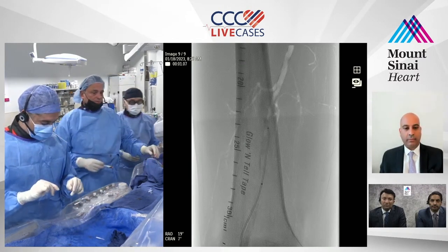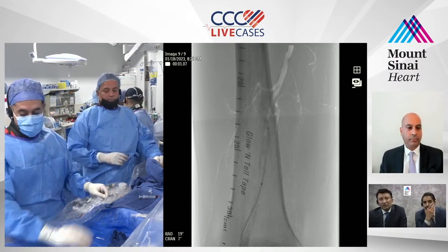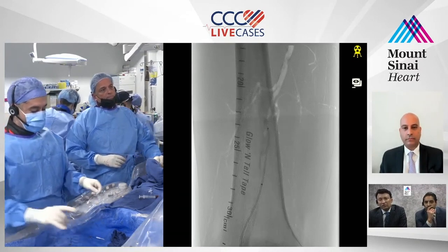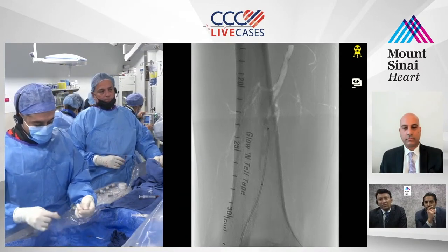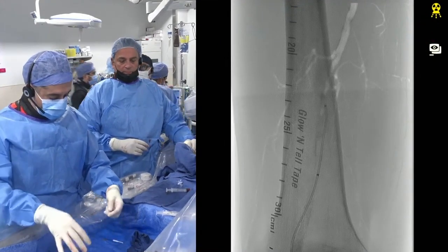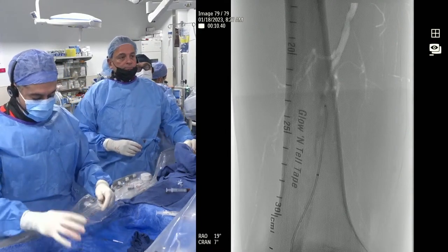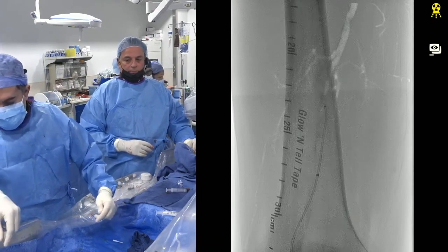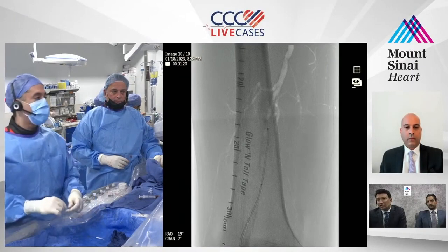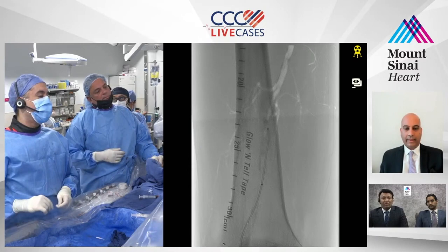So, Srini, if by any chance PK gets into a plane and doesn't re-enter the vessel, would you use a re-entry device from below? Well, at this point he's got a 6 French sheath, right? I have never used it. I'm pretty sure PK has not used it, and Vishal, and none of us at Sinai use a re-entry device from the foot. But have you had experience with it? I've done it. I don't like it.